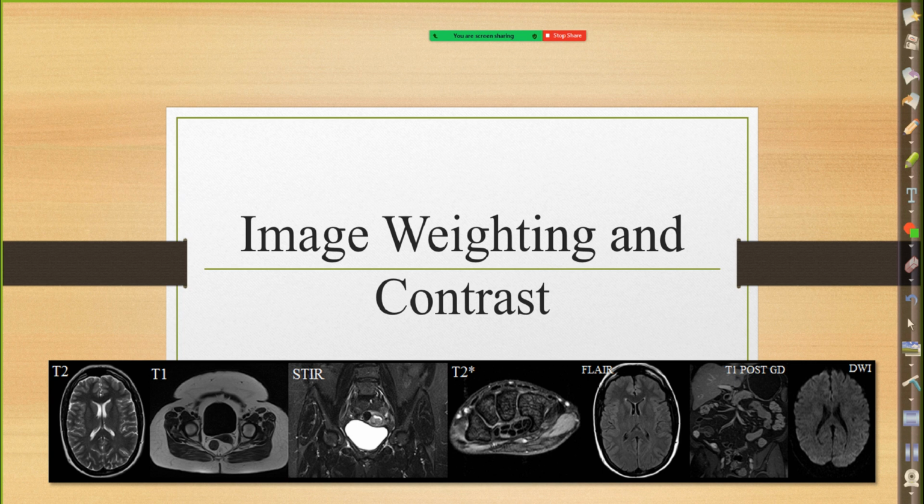So in MRI, we're really imaging the same part and sometimes getting axial slices of that same area. But then what we do is we manipulate the parameters, image weighting, to get a different type of contrast. And each image is really important for sometimes just one or two things. FLAIR, I'm trying to rule out MS, and I'm also really highlighting other pathologies. Diffusion, great for strokes and detecting other pathologies that have restricted diffusion.